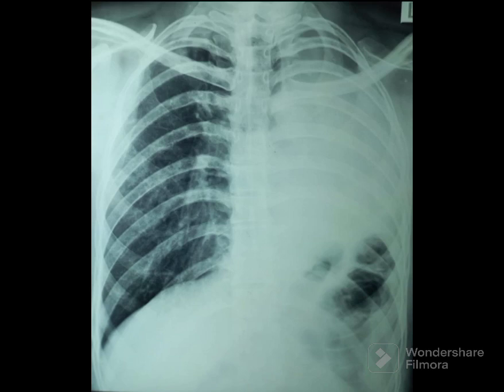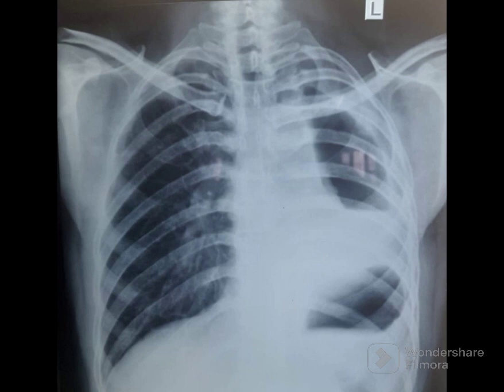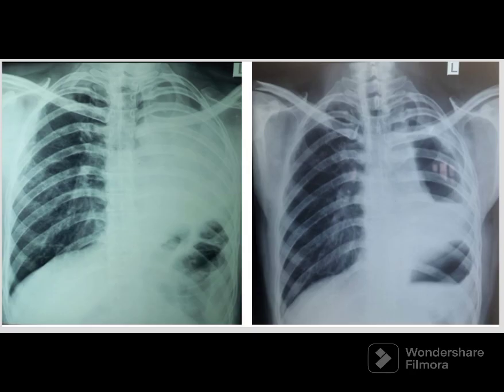Two chest X-rays of the same person are displayed — one taken in 2020 and the second in 2022. Examine both chest X-rays, list out the findings, and figure out the likely reason for the temporal changes in the second X-ray. The presenting symptom in 2022 was inability to lie down on the left side; lying down on the left side elicited severe bouts of cough.